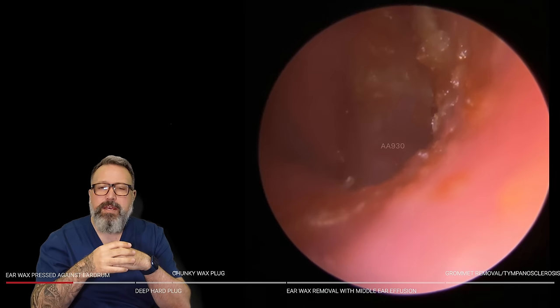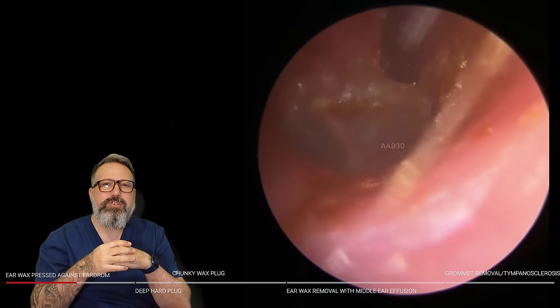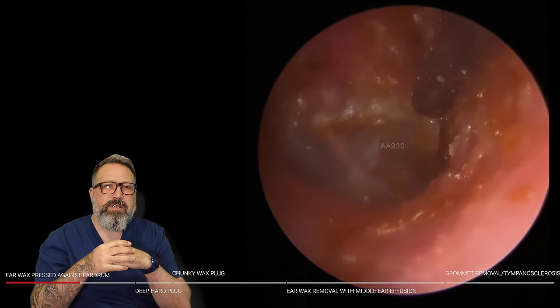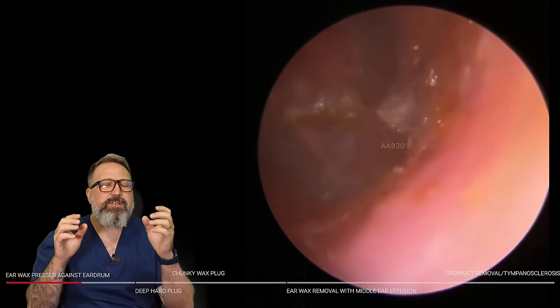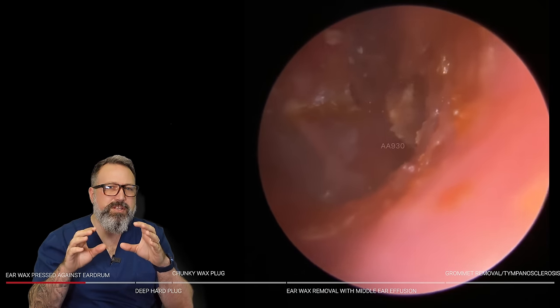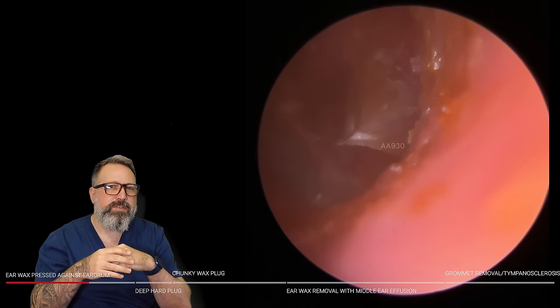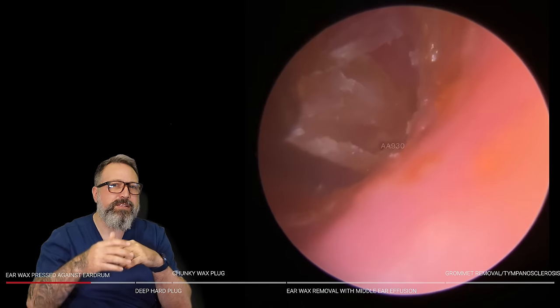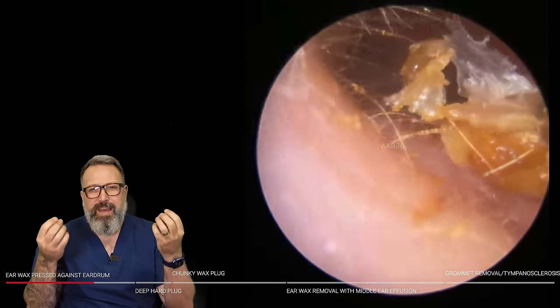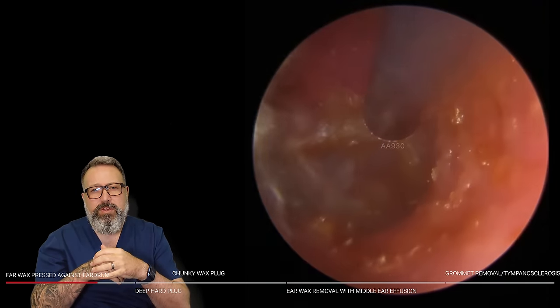Just removing these little bits and pieces. There's just a little bit that was down into that anterior recess. Now this has got really messy because the patient has put some softening drops in — it's gone right down onto the eardrum. You can see this keratin layer we're peeling away, coming off the top of the tympanic membrane, running down over the pars flaccida. This old skin was hanging around on the actual eardrum itself.